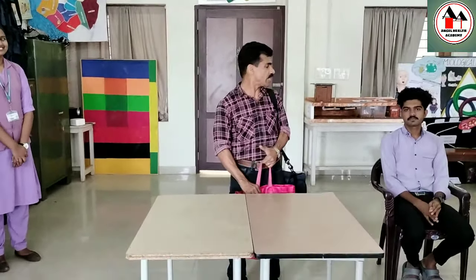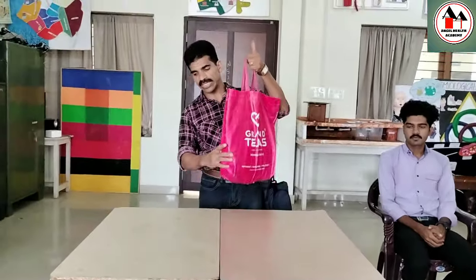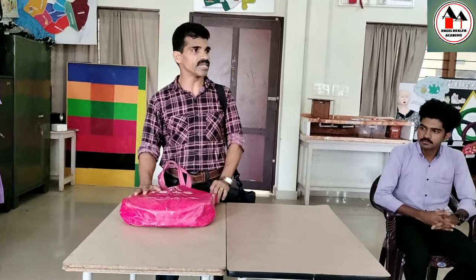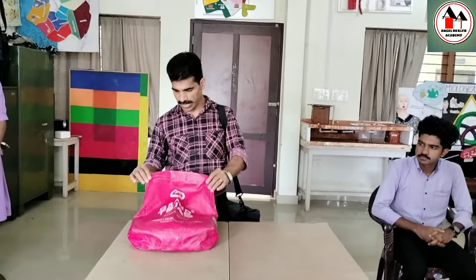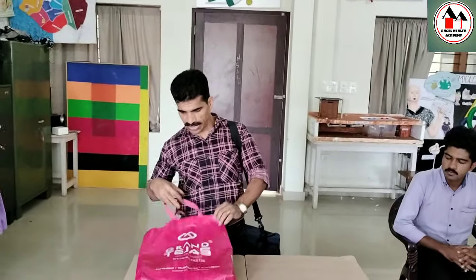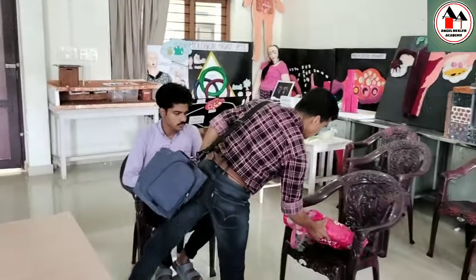Good afternoon students. Today we are going to demonstrate a procedure regarding checking or monitoring height and weight. We need weighing machines, which you cannot carry in the community bag. You can have them in a separate polythene bag along with other articles required for the procedure, and safely place the weighing machine.